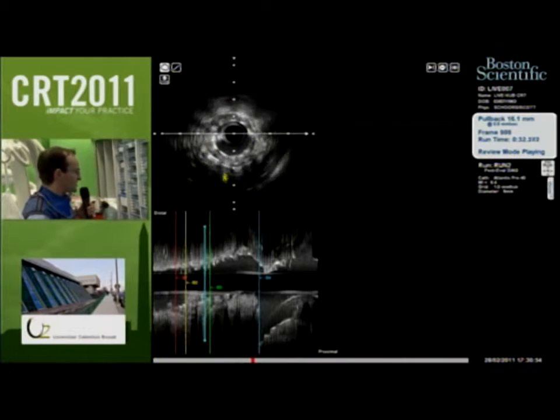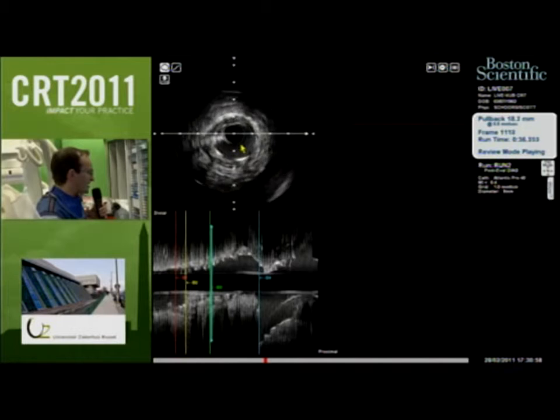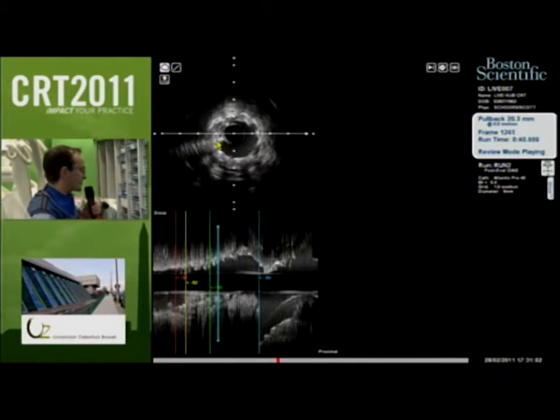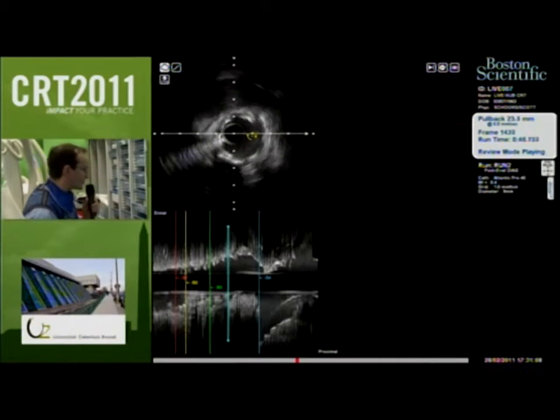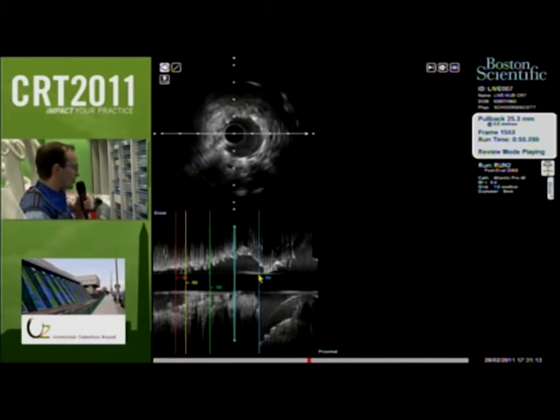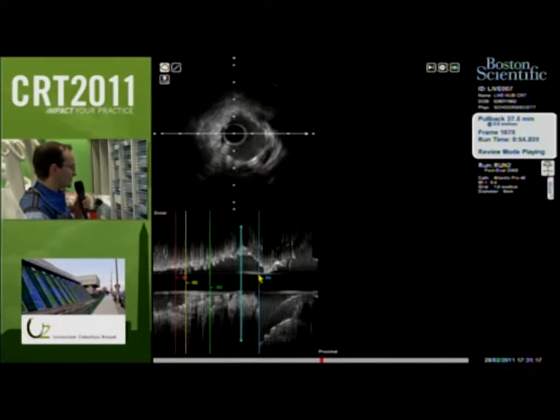But more interestingly, you will have to follow the wire artifact at this level, and we just passed by the overlap of the Tryton stent that we are now examining, and we will approach the bifurcation that you can see coming once you will see exactly two wires coming in the image.